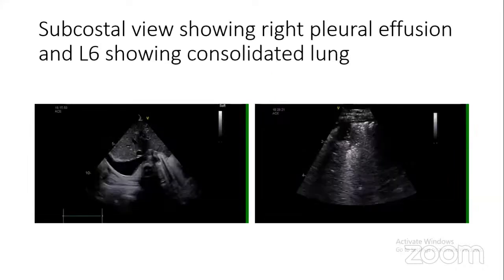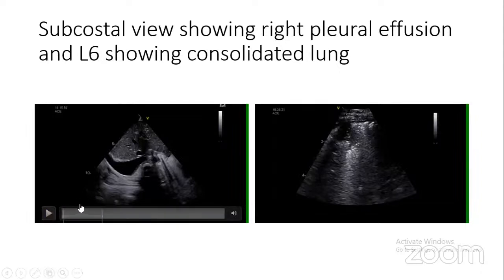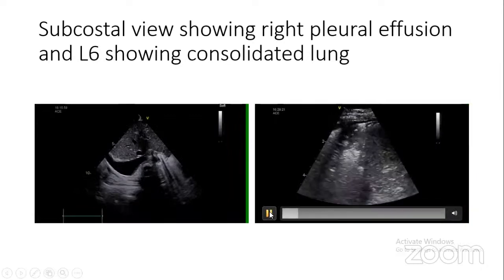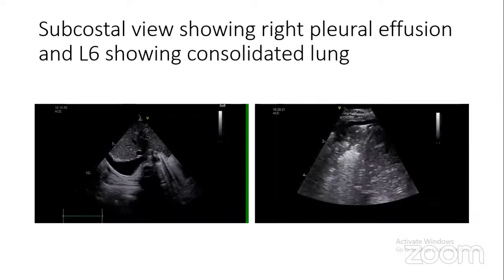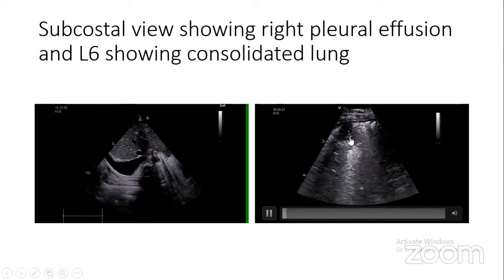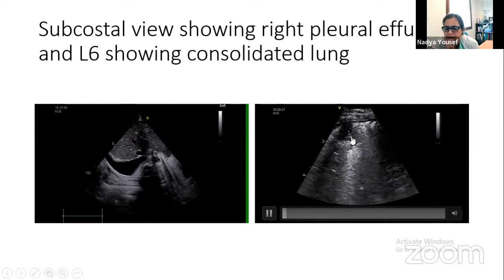This one or this one? So, may I ask, this hyperechogenicity, is it in favor of consolidation in the right image? Yeah, or Dr. Nadya? Oh, it's for me. Sorry. Could you get the clip to move? Which hyperechogenicity do you mean? Hopefully this one. Just below. Just in the middle of the image. Yeah, I see. Where Dr. Atnafou has put the pointer.